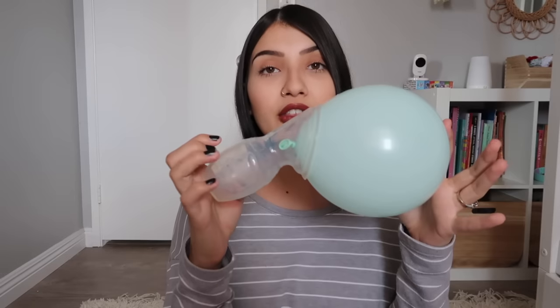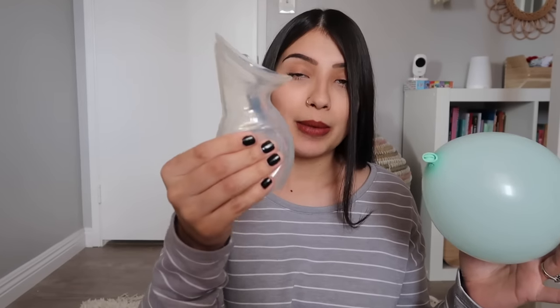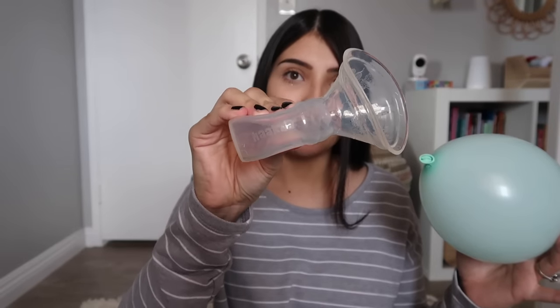Another important thing to remember: the Haakaa should never, ever hurt you. When I first started using it I suctioned it way too much and it left a ring mark on my breast and left it red and hurting. The Haakaa should never hurt you. If it is hurting, take it off and re-suction — this time try not squeezing it as much. Just keep in mind that it should never hurt, and if it does, just take it off and re-suction to get a better fit.